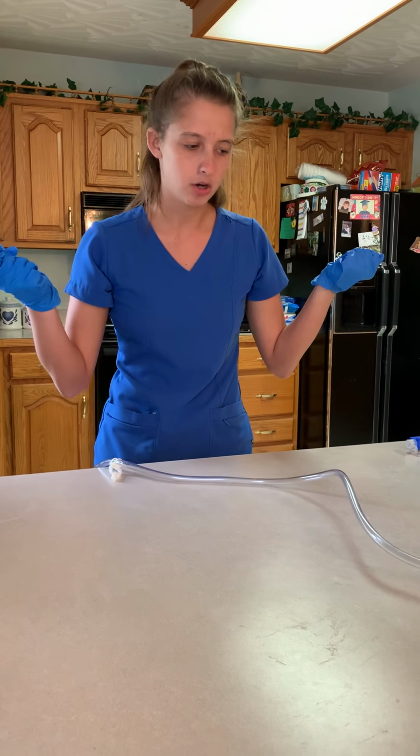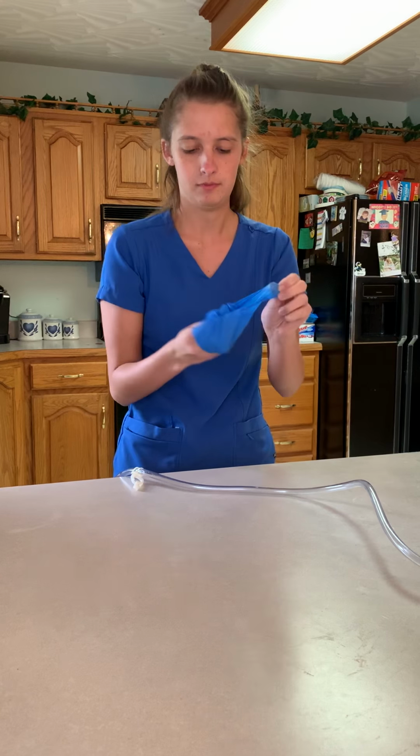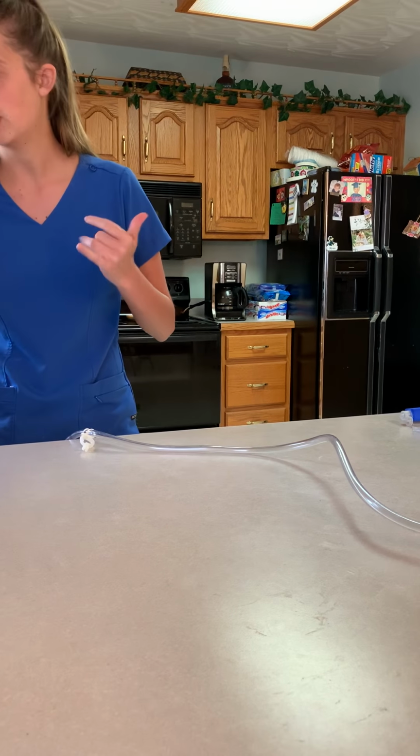Okay, and so now that we have that done, I'm now going to remove my gloves. I'm going to wash my hands. And I'm going to raise the side rail up that's closest to me, and then I'm going to lower the bed back down to its original position, and I'm going to make sure that the patient's comfortable, and then I'm going to document.